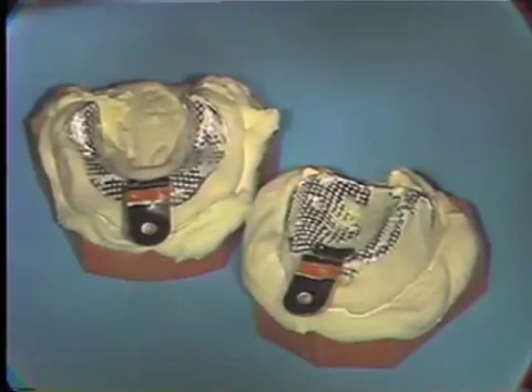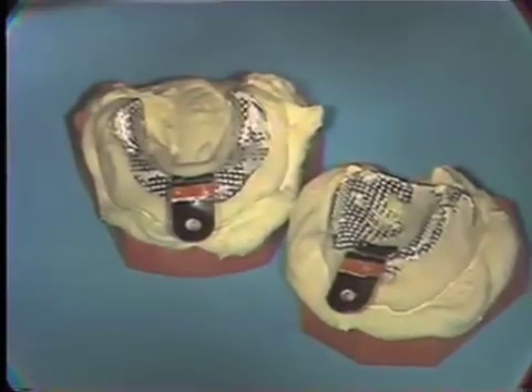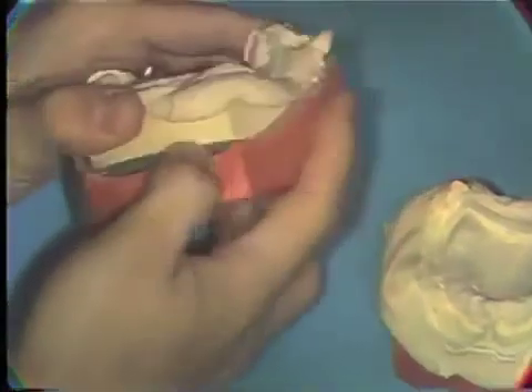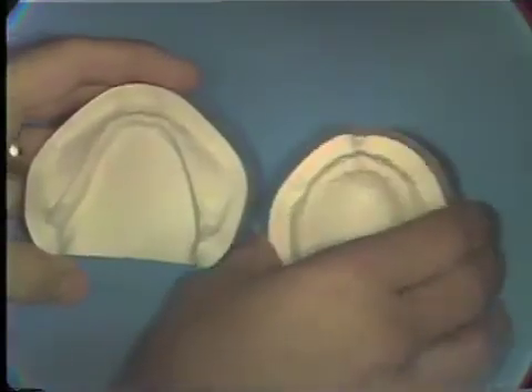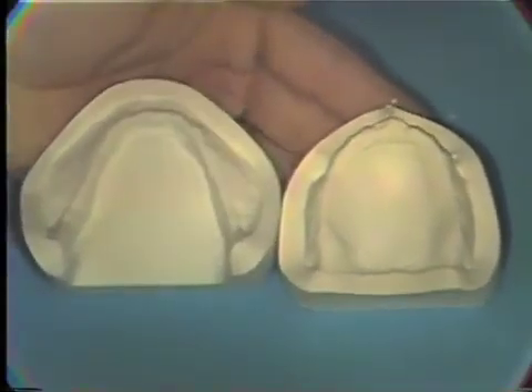After pouring the mandibular impression similarly, being careful to clean out the tongue space on the mandibular impression and allowing the stone to harden, the impressions from the casts can then be separated. The preliminary casts can then be removed from the base formers. After thoroughly wetting the surface of these casts, they can then be taken to the model trimmer and trimmed such that the final preliminary model will have a landing or boxing edge of approximately one quarter inch around the entire periphery.